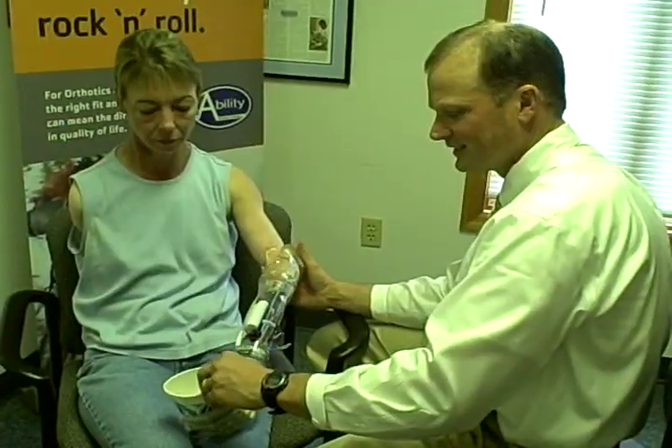The i-limb stands for intelligent limb. It's an electrode-based hand that allows multiple movements.